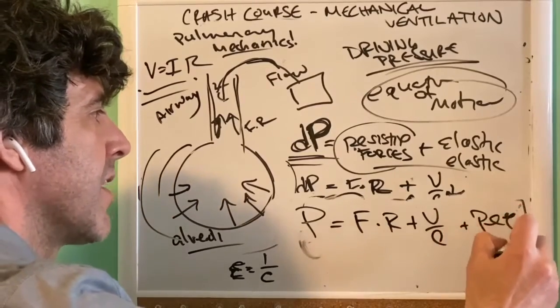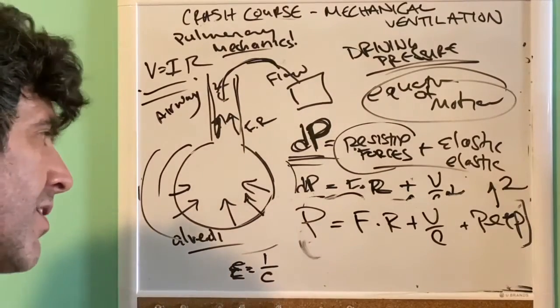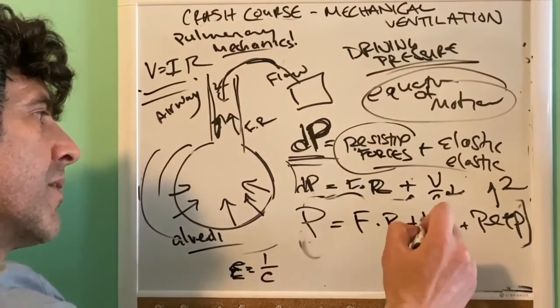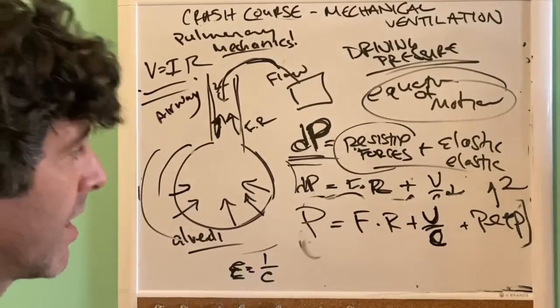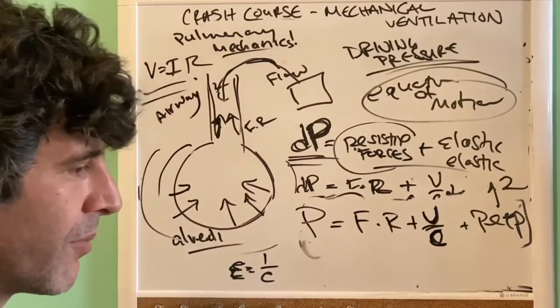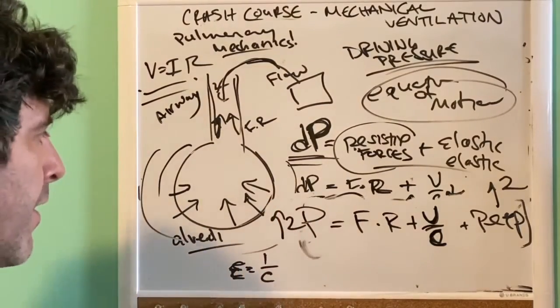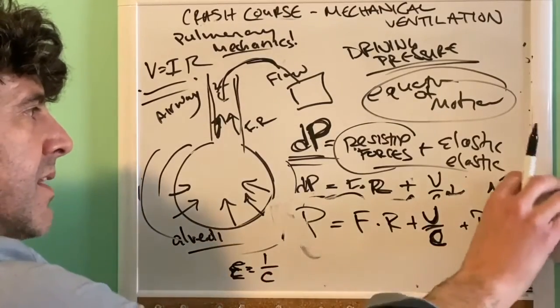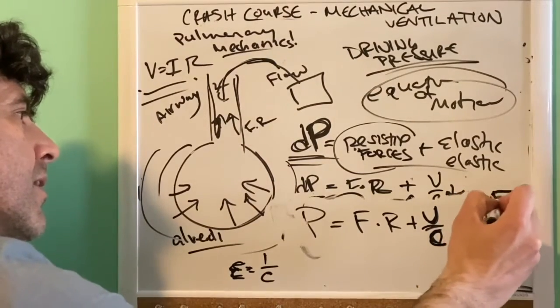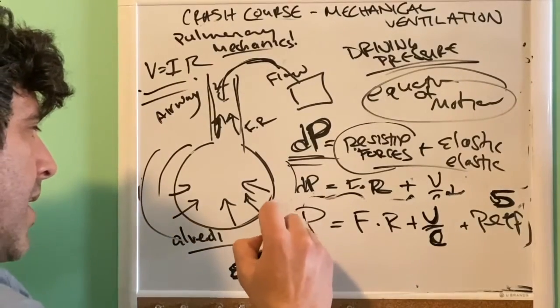But let's say, for example, we increase the PEEP by 2. What would we expect, and we'll talk about the pressure volume curve and where we are on it, but what would we expect if our compliance is staying the same, our volumes are staying the same, we didn't change that, and we still have the same tubing and the same resistance? What would we expect from the pressure on the vent? Well, you'd expect this to go up by 2. Let's say we increase our PEEP by 5, and let's say the pressure on the vent that you require is 10.